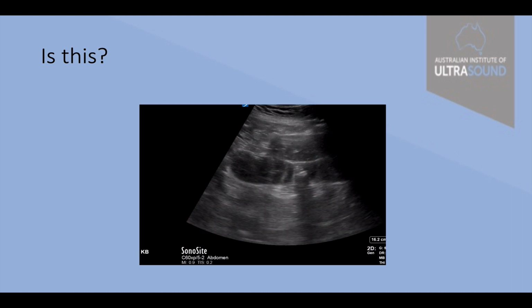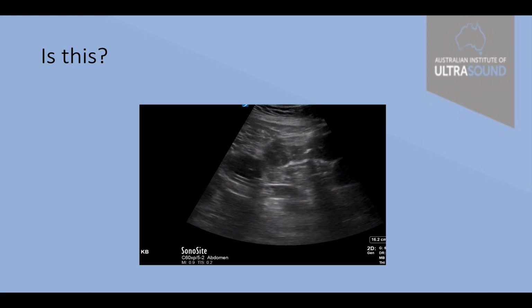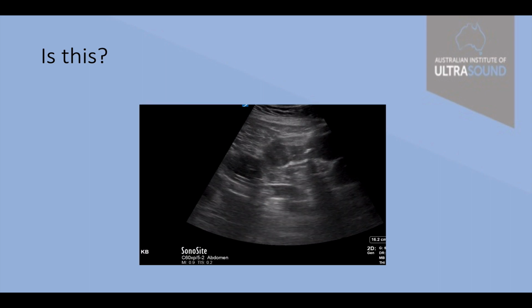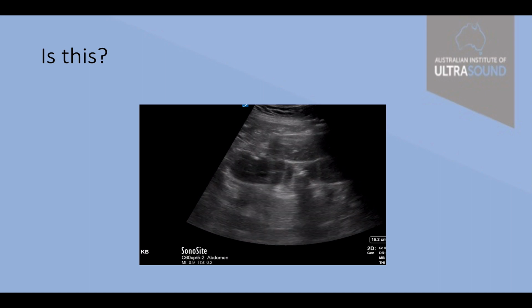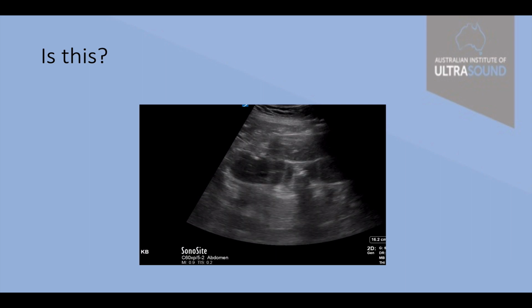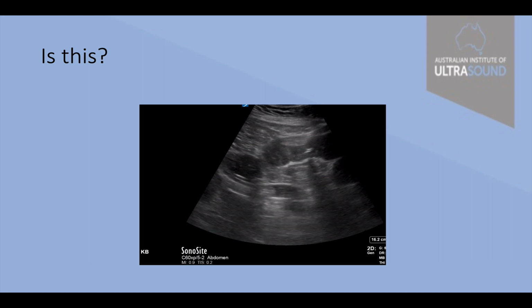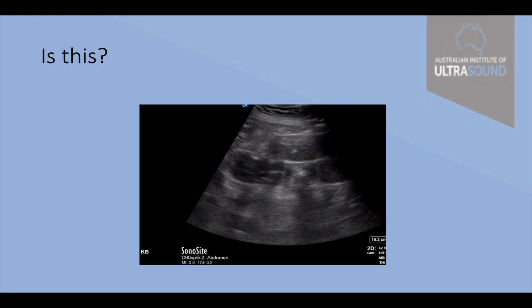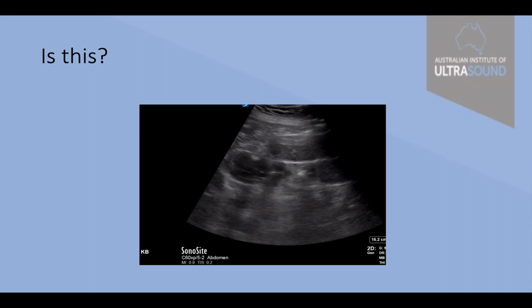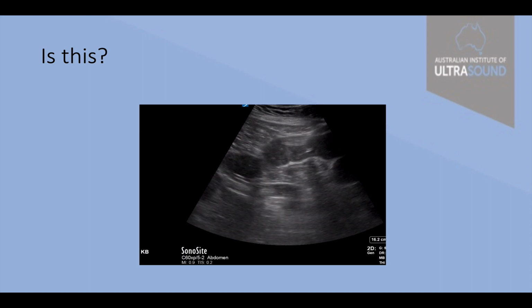What about this? Isn't it nice that you can see the movement? Bounded or unbounded, would you think? This is actually normal peristalsis in small bowel. Perhaps there's a bit extra fluid in this loop of small bowel. If I saw something like this, I'd want to look further around and see just how many loops of bowel seem to be a little distended.